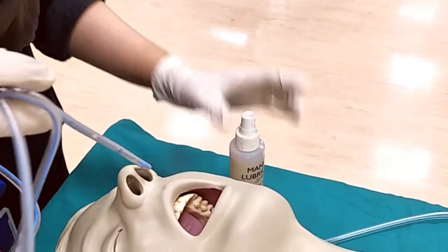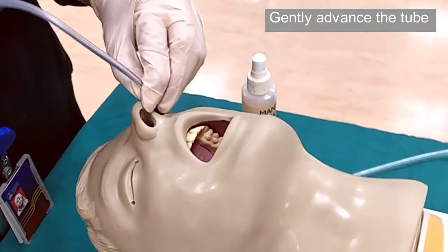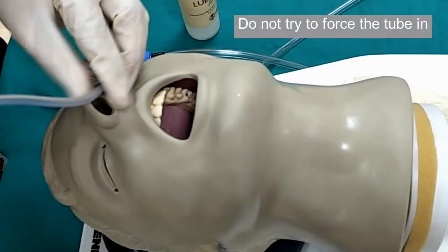Insert the tube through a nostril. Gently advance the nasogastric tube through the nasopharynx — this is often the most uncomfortable part for the patient. If you feel resistance, gently rotating the tube can help. However, do not try to force the tube in.